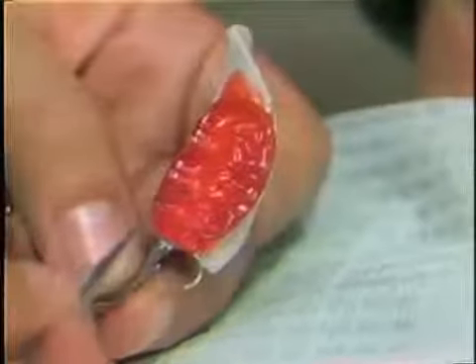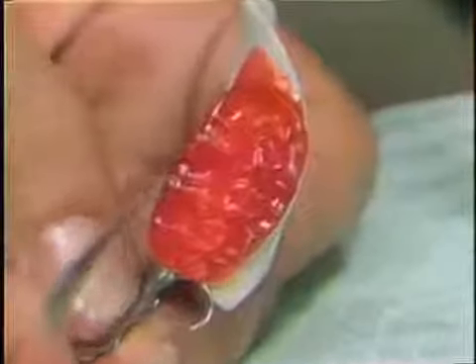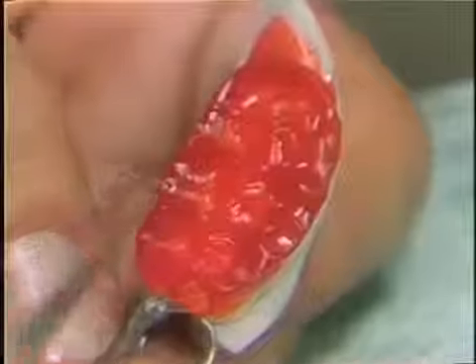And we do see some guidances coming out this direction for the working, this would be the working path of the maxillary cusp. And you see she spread the wax around away from that initial indentation that she has made.